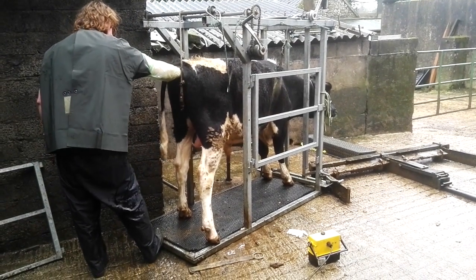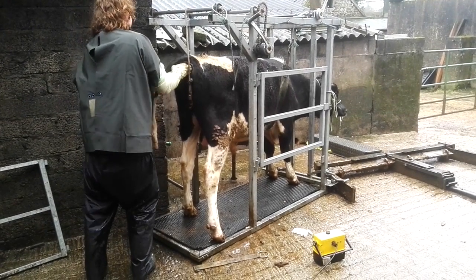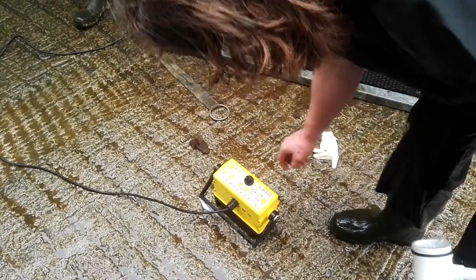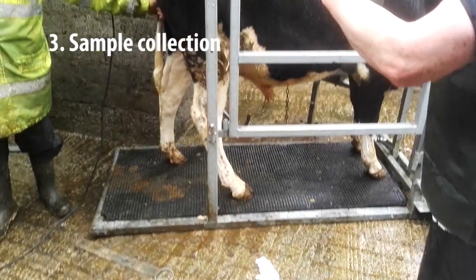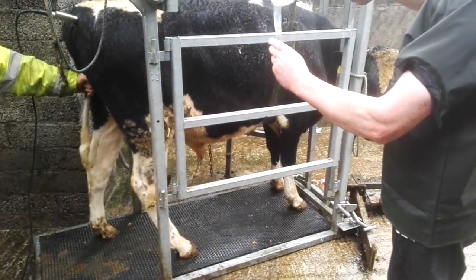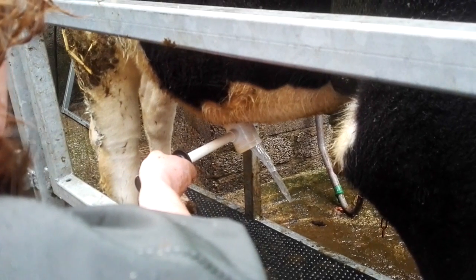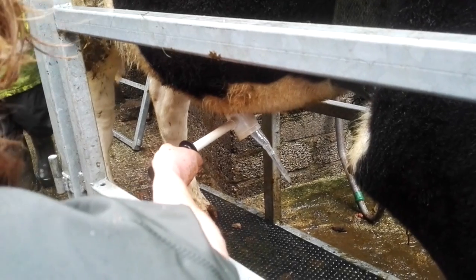I'm going to move on with the hands, taking a good sample off this bulb. The fluid was the first bit that was clear, and then the semen came, made it cream.